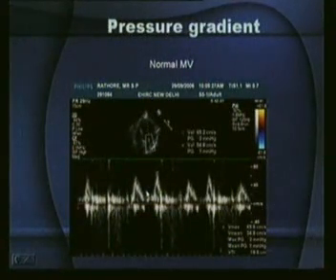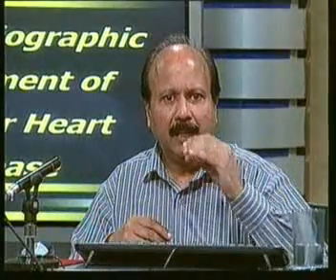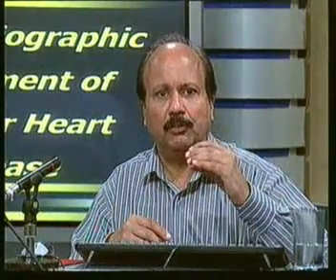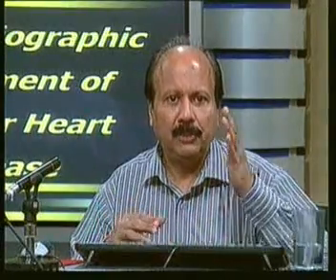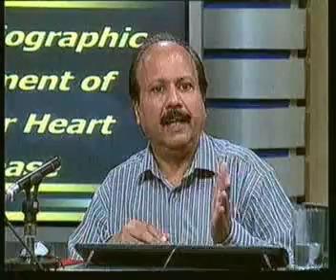Now, because this person doesn't have mitral regurgitation, he has no other lesion, therefore the systole is relatively quiet. You find nothing here. And when you know what a normal looks like, then you will appreciate it very clearly. It exactly depicts the hemodynamics of the blood flow from the LA to the LV: the first onrush of blood, the diastasis, and the A wave.